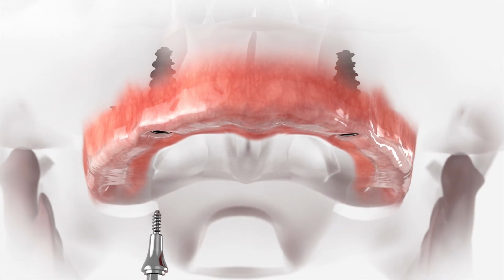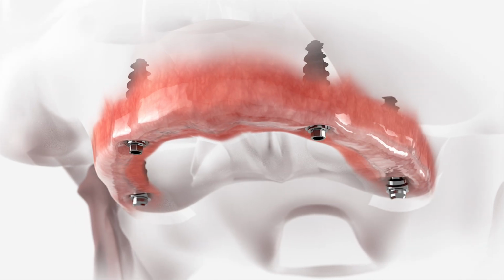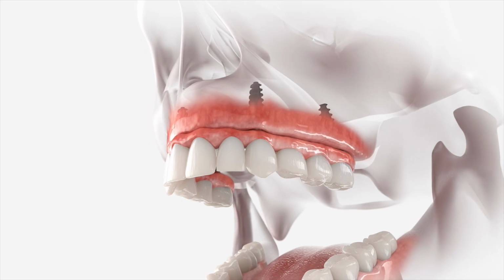Or imagine placing an implant in the posterior maxilla where only 3 millimeters of bone remains. Without a sinus lift, this case is impossible. With proper planning, however, it becomes routine.